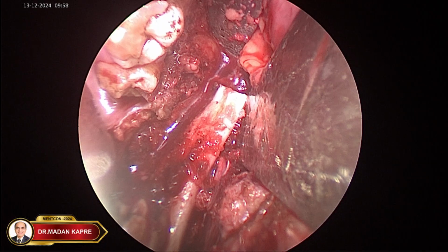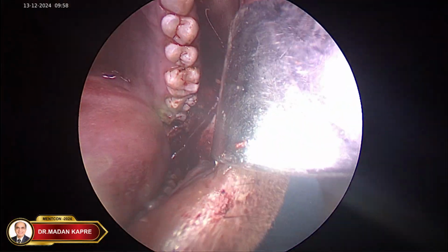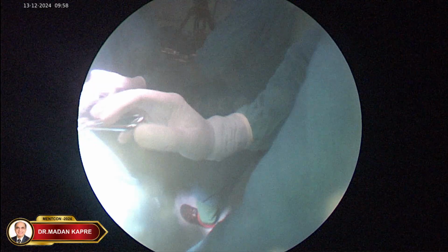And it's about, you can see it from a distance. Can you bring that camera down now? Just to show the mouth opening now.